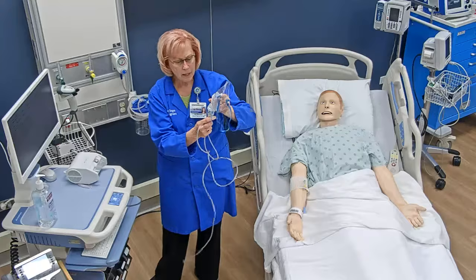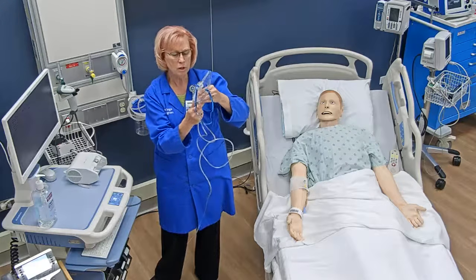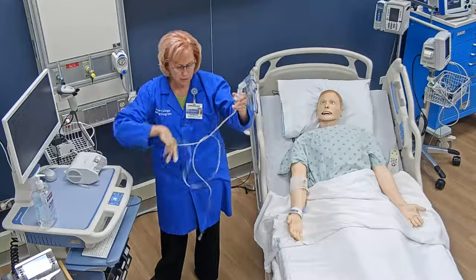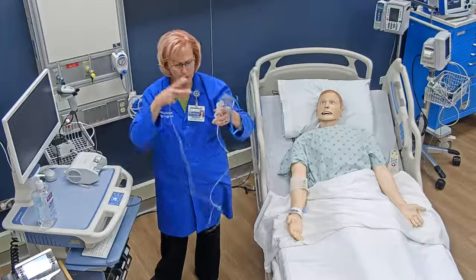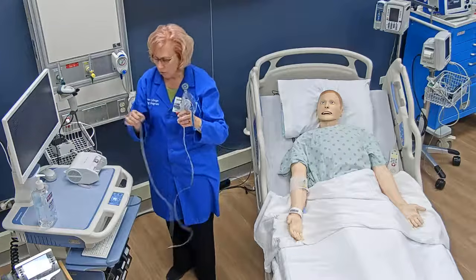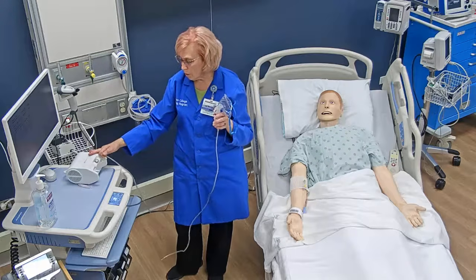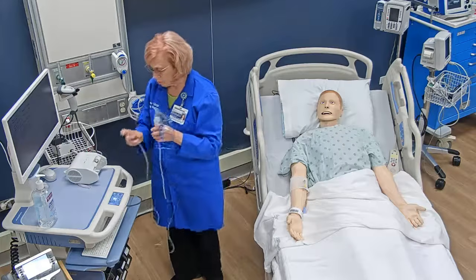Put the mask back on. Make sure you click it into place. It turns into place. And now I have 2 options for setting this up to get the medication aerosolized, or up into the air. One is to use a machine like this. This is what they use in long-term care or in subacute rehab and in people's homes. Many people have a machine like this at home.